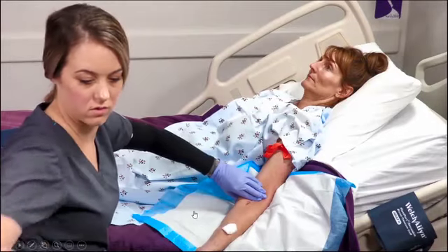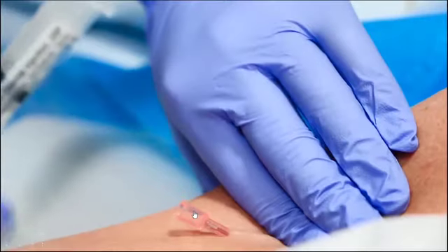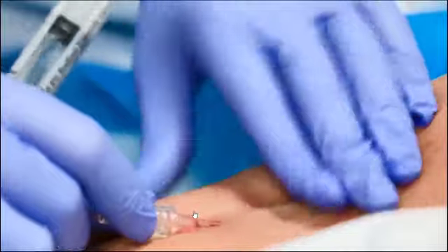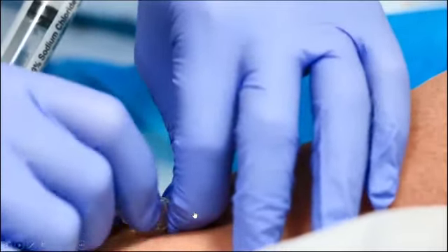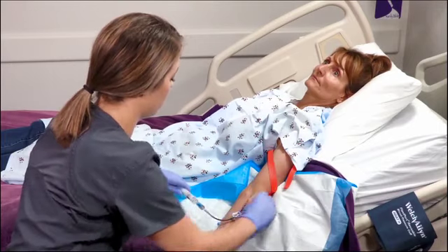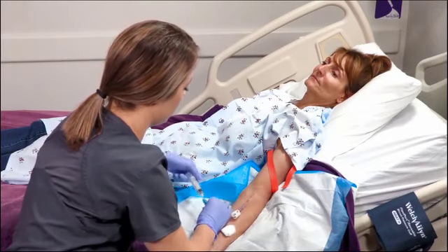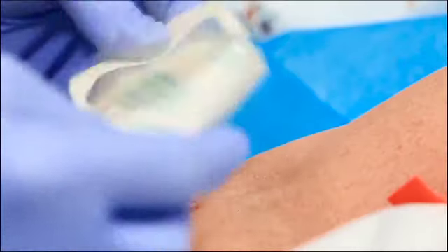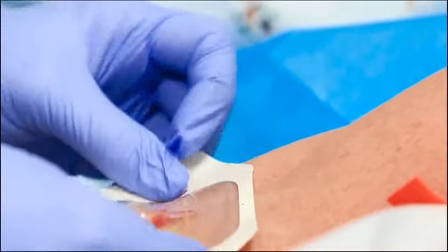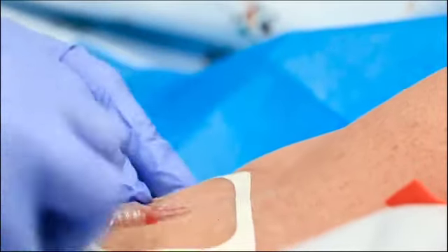This is another method you can use. It's called tamponade. Then apply the extension set. This extension set is already primed. Now, one other feature that I want you to check out is this. She will pull back and see blood in the extension set and then flush it through. Once that's done, you're going to clamp off that extension set to keep blood from backflowing into that set and to keep clots from messing up your IV.